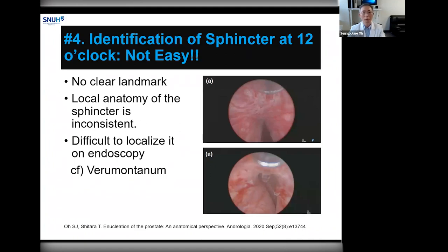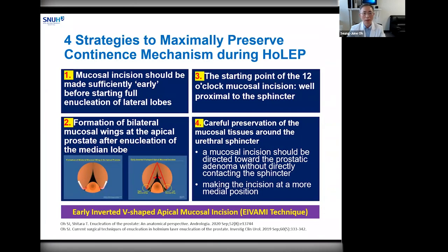Last, identification of the urethral sphincter at the 12 o'clock position endoscopically is not easy. Many surgeons describe the sphincter location at 12 o'clock as just opposite to the verumontanum, but practically there is no clear landmark for it. The local anatomy of the sphincter is not consistent, and it's difficult to exactly localize the urethral sphincter at the 12 o'clock position endoscopically. With all these in mind, I have applied sphincter anatomy to my surgery, modifying my technique over the last 13 years. I now have clinical outcomes with very few patients suffering from postoperative urinary incontinence. Here I have summarized four strategies to maximally prevent urinary incontinence during HoLEP.